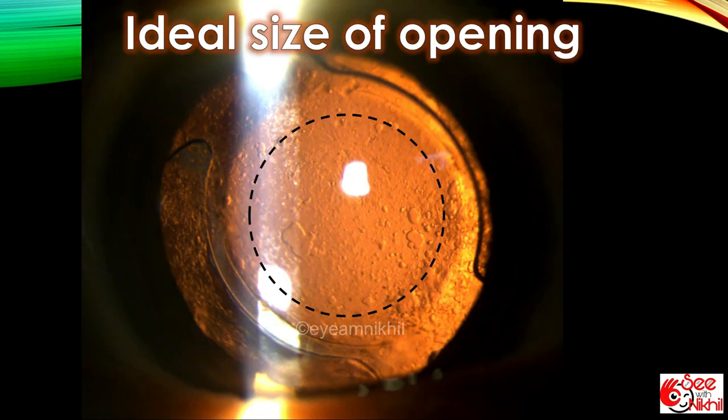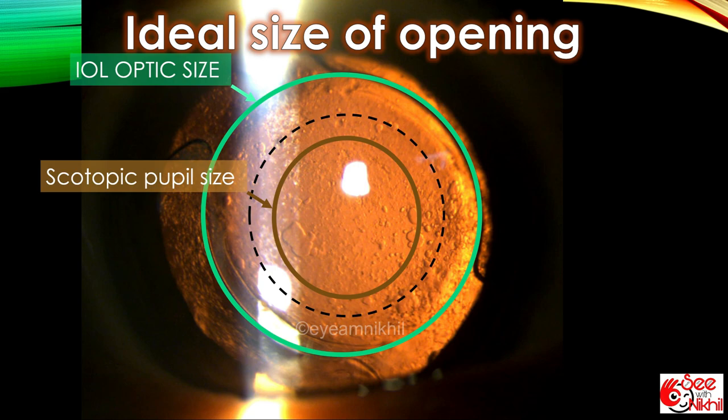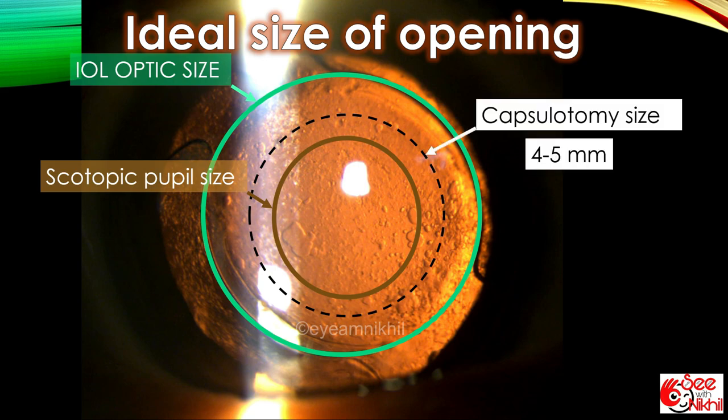Size of capsulotomy should be less than that of the IOL optic size but greater than the pupil size in scotopic conditions. So it is roughly around 4 to 5 millimeters. A capsulotomy that is larger than the optic size can result into vitreous prolapse.